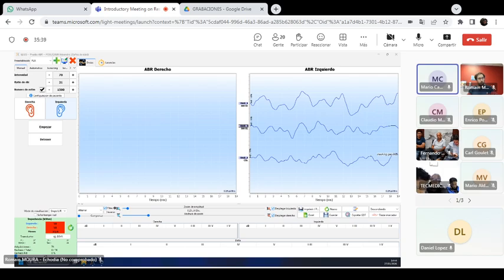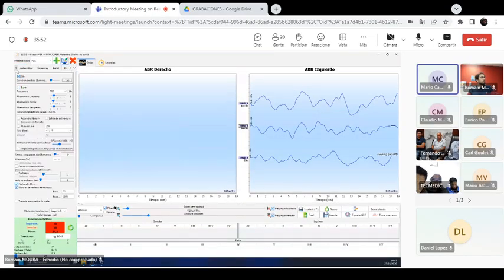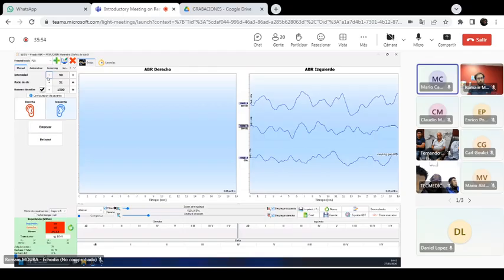But anyway, if it's really needed, I think it's just a matter of a license, because for sure this type of requirement is quite basic. So I think the unit is capable of achieving these intensities and working in the range that you described before.